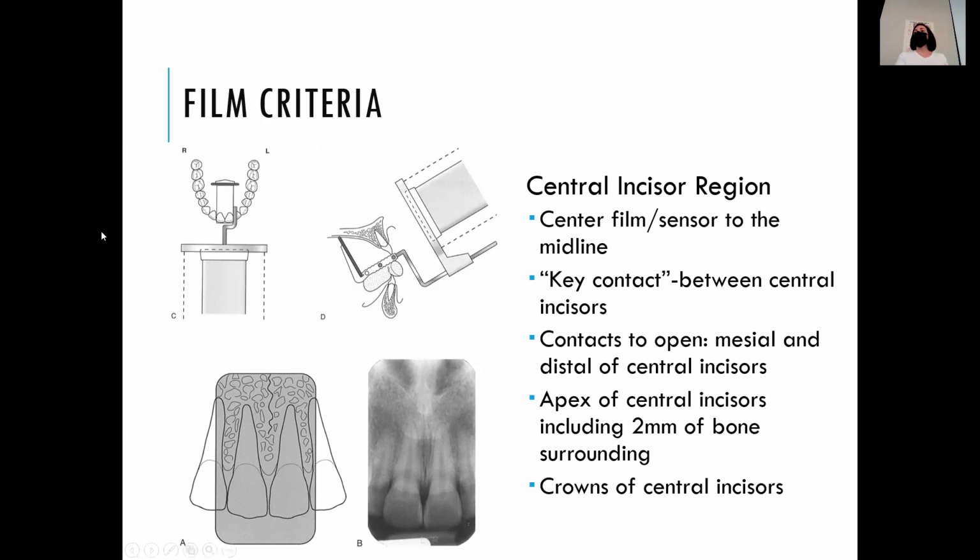So it says central incisors. So here's your central incisor film. I'll just talk through a couple of these, but I'm not going to spend too much time on each one because it's just things that you want to know for criteria for each film.